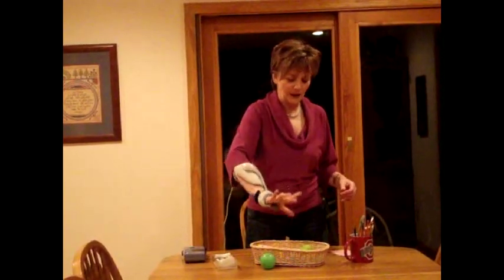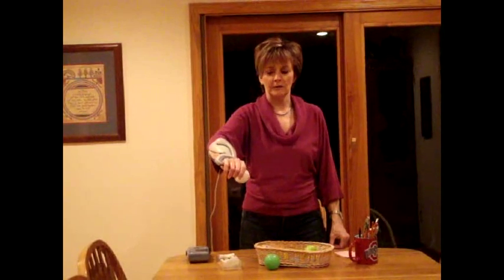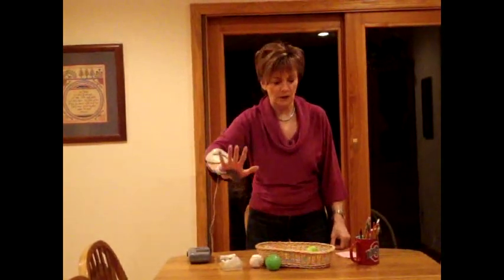See, it's opening up my hand again. I'm going to pick up another ball, and I had to hold it until the machine opened up my hand, and then that made me let go of the ball.